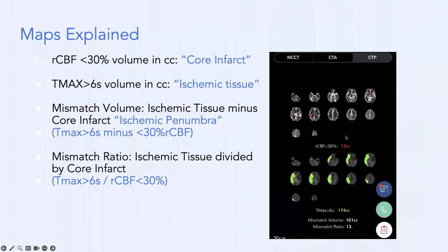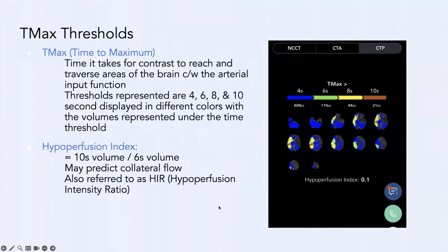Looking at a sample patient: CBF <30% (surrogate for core infarct) is 13 cc's; Tmax >6 seconds (ischemic tissue) is 174 cc's; mismatch volume (ischemic penumbra) is 161 cc's; mismatch ratio is 13 — a very high therapeutic ratio, making this a good candidate for thrombectomy. On the app, thresholds of four, six, eight, and ten seconds are provided; we generally use Tmax >6 seconds for acute ischemic tissue.